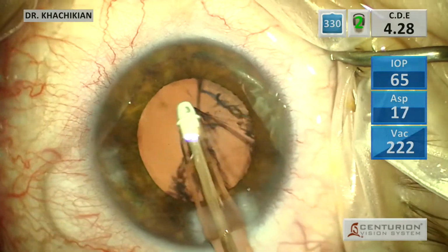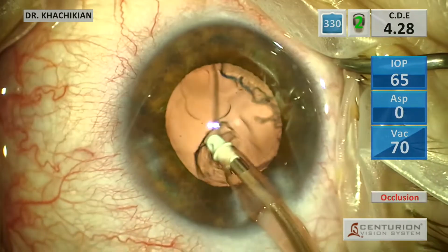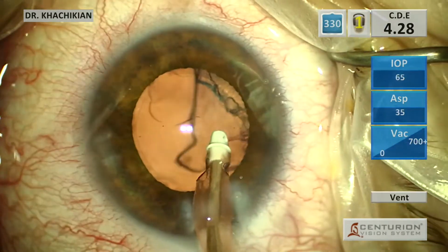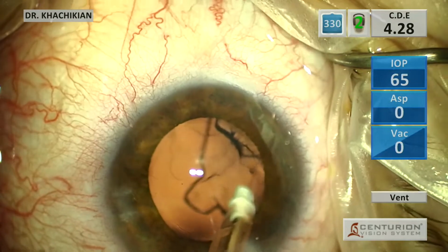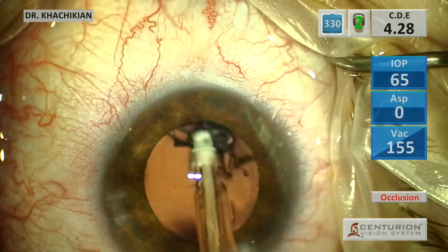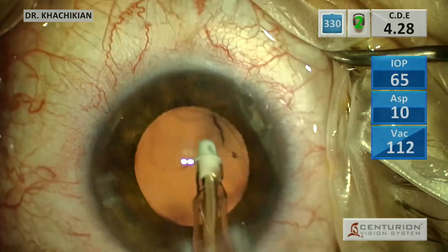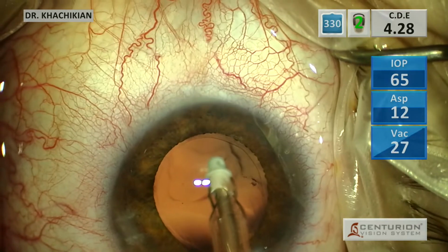Then we're going to kind of sweep. I do use a sweeping motion to remove the cortex, try and get some subincisional cortex here, and just grasp just under the capsular rim and sweep to loosen up the cortex and pull it. You'll notice the instruments tend to remain fairly central throughout the case, both the phaco handpiece and the I/A handpiece, as much as possible.